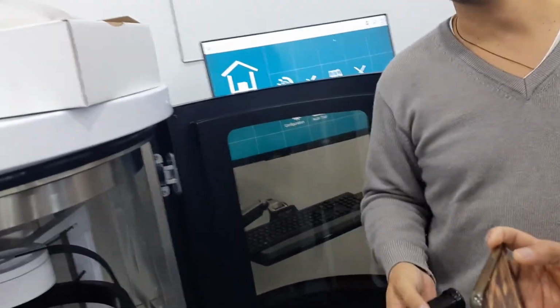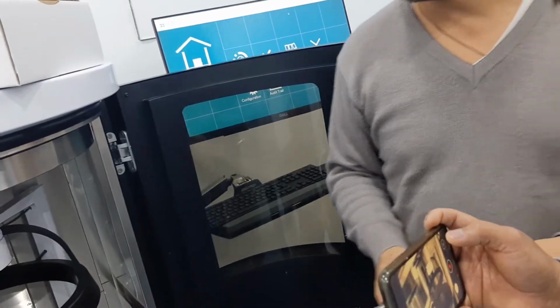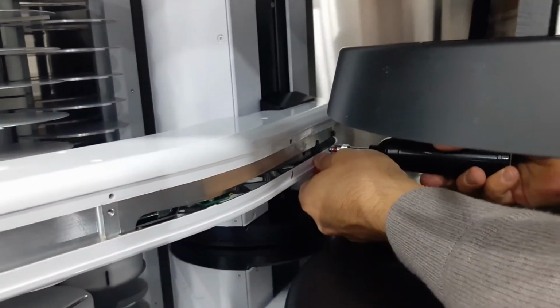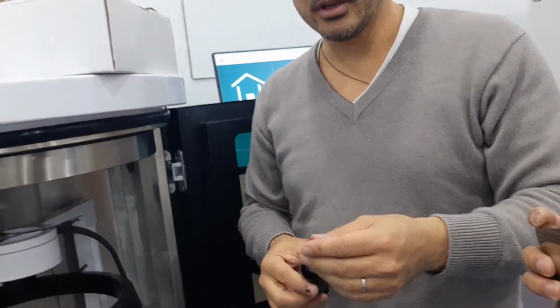Most of the time, you don't put anything. You wait, you're like, shit, nothing came out. So I don't know. I think it's a valve. So it's the pressure. You have to apply it like that, and you have to push like. So it's better if you have somebody holding the arm, holding down, and then you have to try to push like that. So you have to put quite a lot of grease.